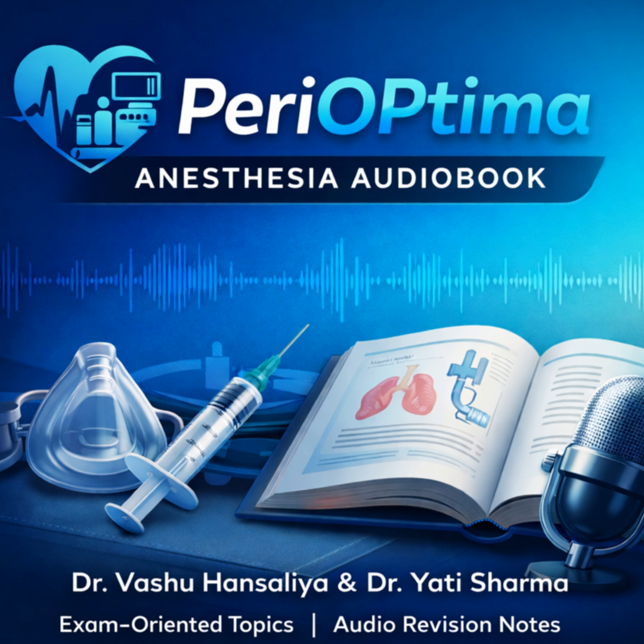Absolutely. The foundation of SGAD classification, and this is the most relevant system for both clinical prediction and for exams, is based on the device's sealing mechanisms. Okay, the seal. Yes. This is often attributed to Miller's classification system. And understanding the seal is key because it tells you two things immediately: the maximum achievable seal pressure and, critically, the device's potential for gastric access and aspiration protection. So it's the functional capability that drives the categories, not just the history of the device.